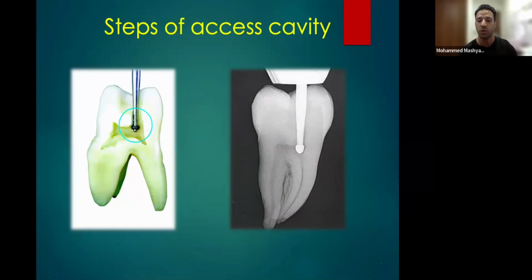All the movement is lateral movement. And this is true if you have the calcification. If the pulp chamber is calcified, just measure from the top of the cusp to the area of the pulp chamber and do your measurement and do the drilling with the burr.